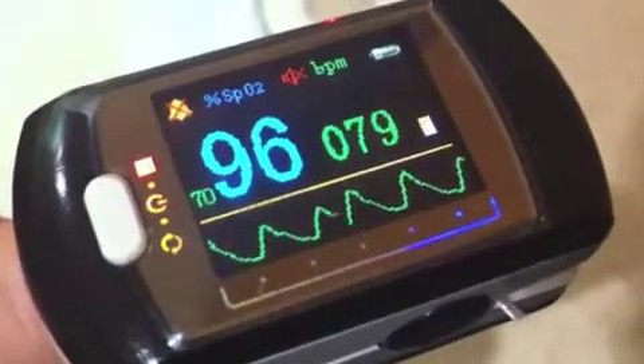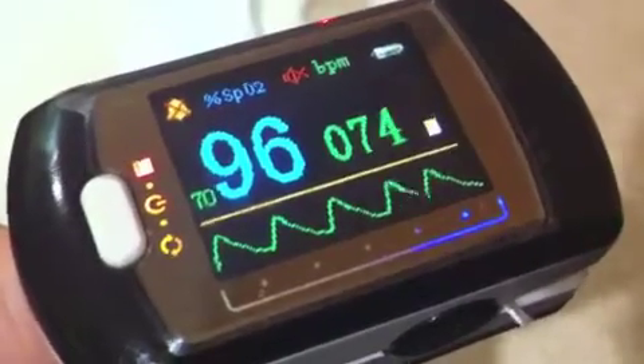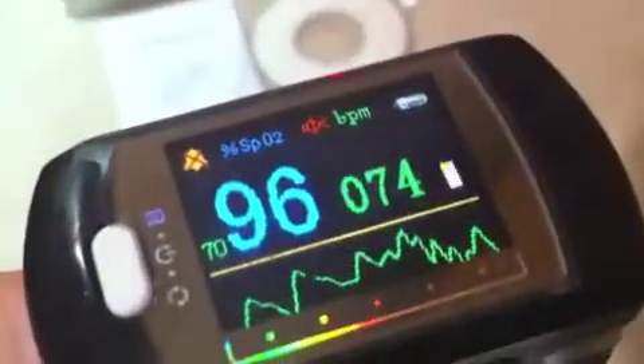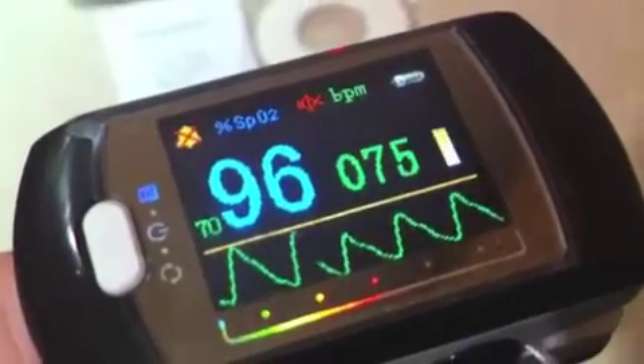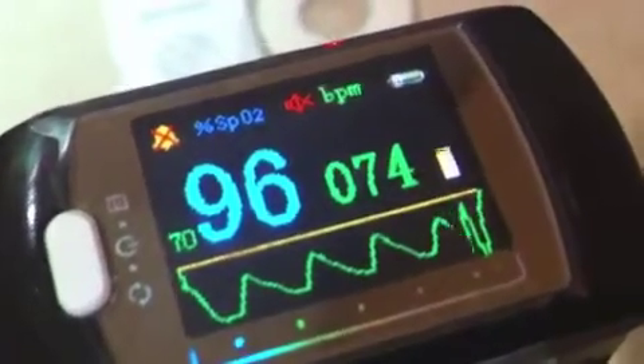I would make one caveat with this, which is that the pulse rate readings seem to be perturbed by movement, whereas the oxygen levels don't. Just to demonstrate with my finger — you can see the signal on the bottom half of the screen, which is my pulse rate, moves quite erratically when I perturb it.